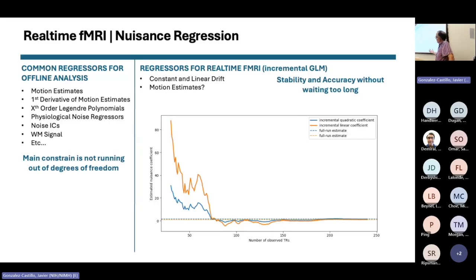Now, what people tend to do in real time, you can look at the fits and see how long it takes to get to a point where those fits are stable. And that's when you say, okay, this is the model I'm going to use. And in all of my runs, definitely I'm not going to be doing any neurofeedback until second 100 because I need all these time points for these algorithms that work in an incremental way to be stable. That makes sense?